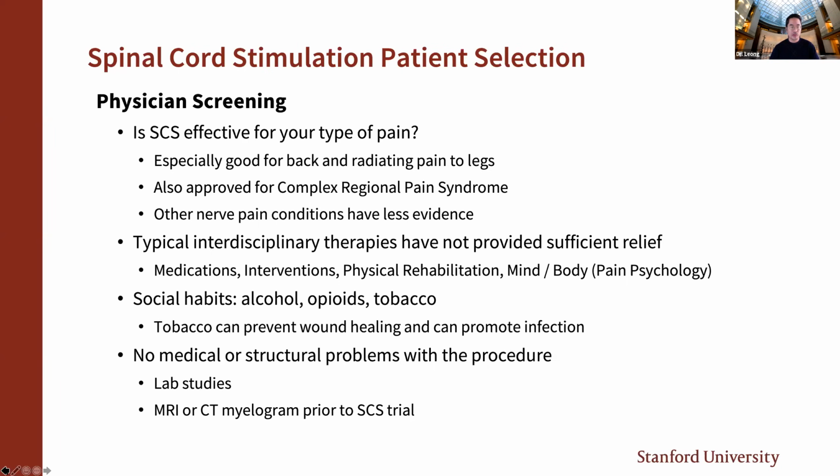And that involves multiple physicians, not just pain management, but internal medicine, neurology, etc. We'll have pain management psychologists involved in the discussion, and we pick the best device that will fit your pain condition, and it's our best guidance on what it could be. And it may not be what we thought of initially or what you were expecting for spinal cord stimulation or a certain technique. There may be things to do before that even. So that's our plan with that.